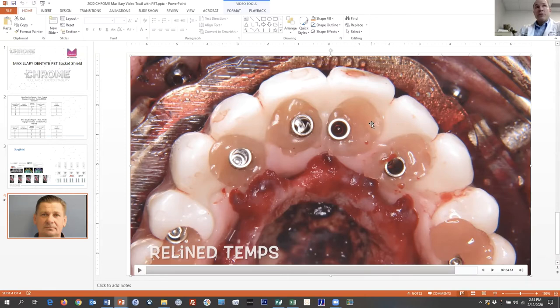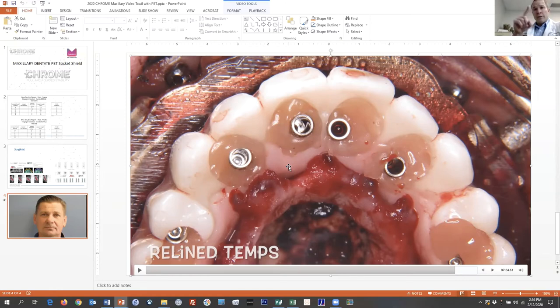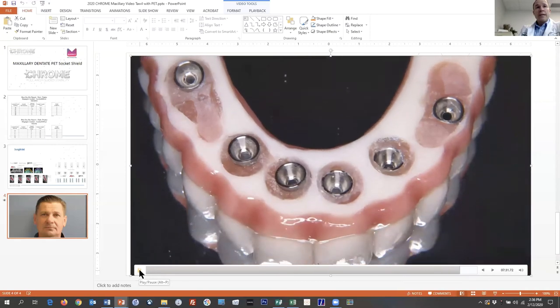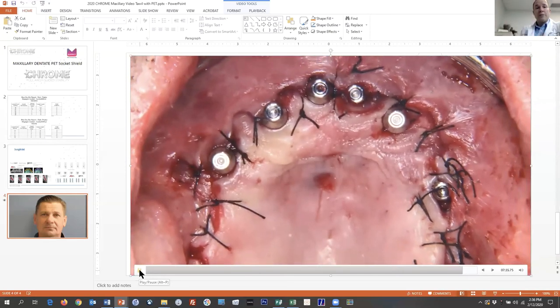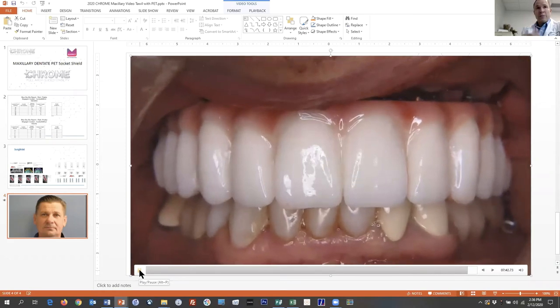A chair-side tip: place one temporary abutment at a time, fit your prosthesis, then check the next. It's much easier to detect which one is slightly off. If you put them all on and then try to get a path of insertion, you don't know which one to adjust and end up cutting the life out of your prosthesis. You can see the occlusal image has holes bigger than designed — straight holes are 6mm, angled holes are 7mm, but these are 8-10mm — the doctor was adjusting. Sometimes on the cingulums of anteriors you also need to adjust the tops of the temporary cylinders.